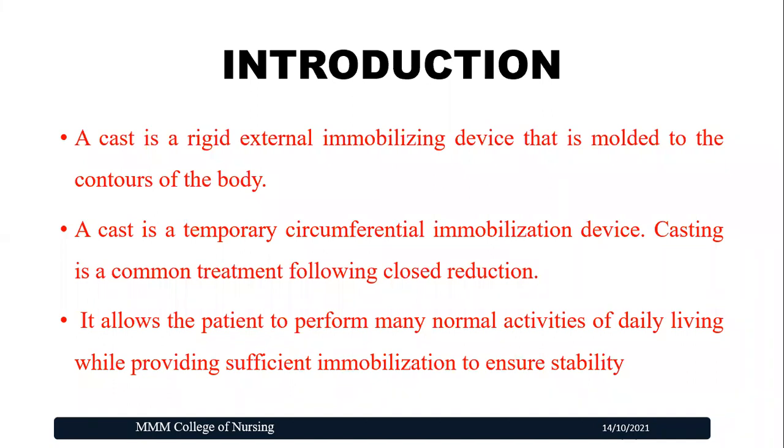Mainly, this POP allows the patient to perform many normal activities of their daily living without much interruption, while providing sufficient immobilization to the part of the body that it is being applied to, so that the stability of the body part will be ensured with POP.